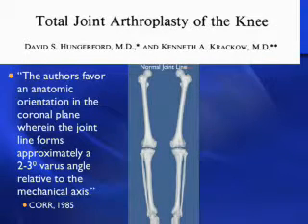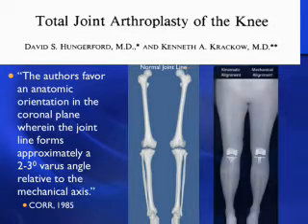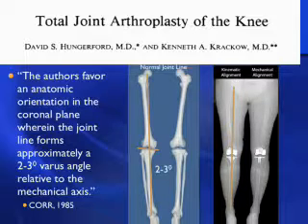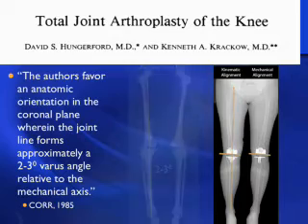Here you can see a projection of the normal joint line in 3D models recreated from CT scans. And here's an example of the kinematically and mechanically aligned knee. And there's the weight-bearing axis, and the joint line is in about 2 to 3 degrees of varus. That's the normal limb, and that's indeed what we're trying to restore with our kinematically aligned knee. And when you look at the mechanically aligned, it's actually turned in the opposite direction in this particular example. And remember that that variability can be almost 20 degrees within a subject.